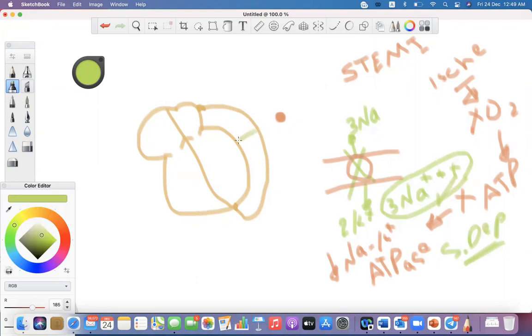So if there is a transmural infarction, as in cases of acute myocardial infarction, STEMI, the whole myocardium will show increased activity, a homogeneous increase in its activity, producing more electricity.